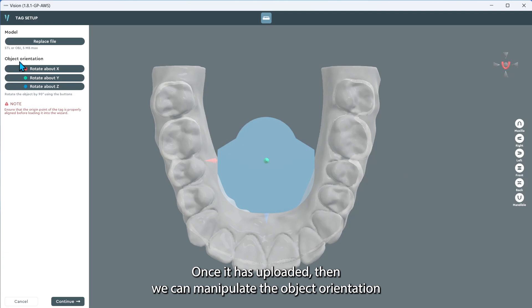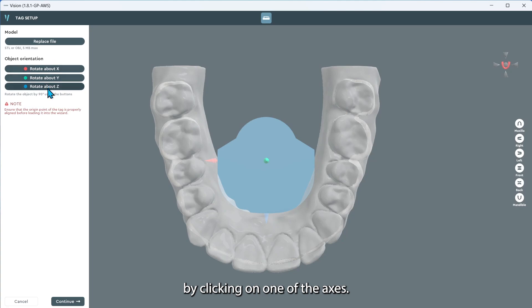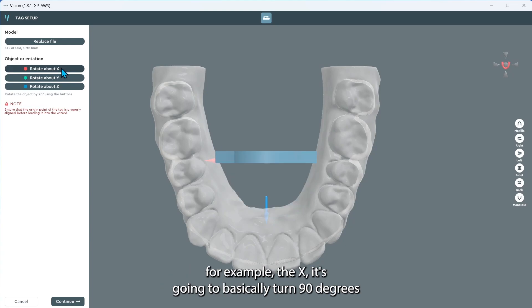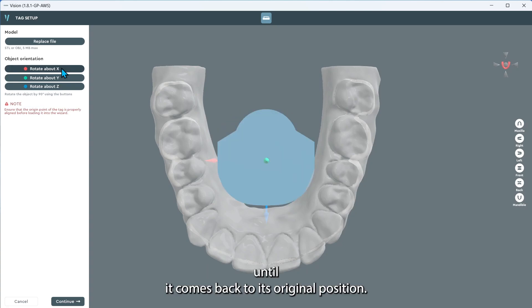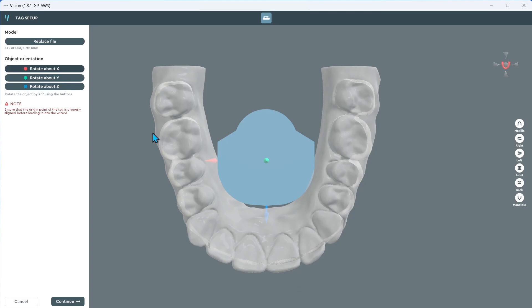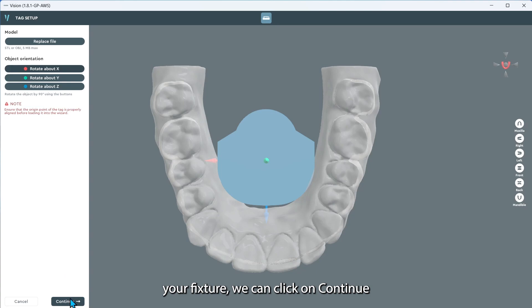Once it has uploaded, we can manipulate the object orientation by clicking on one of the axes — X, Y, or Z. By clicking on the button, you'll see that every time I click on, for example, the X, it's going to turn 90 degrees until it comes back to its original position. You'll be able to position the fixture to what's ideal for your production. Once you've manipulated your fixture, we can click on continue.